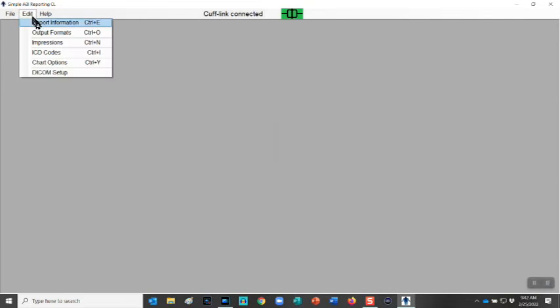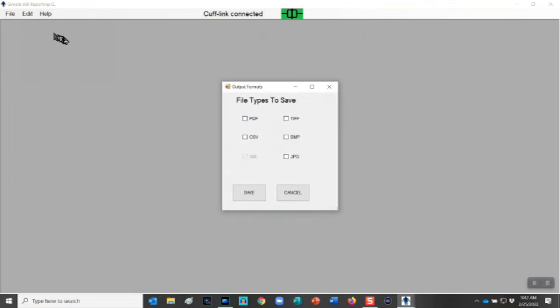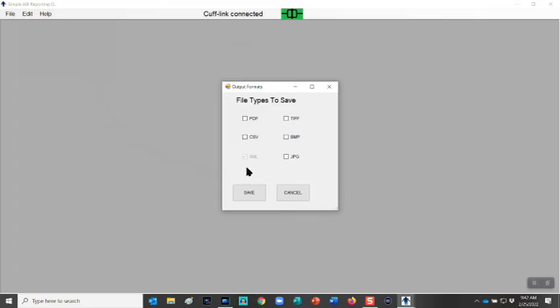To choose your desired formats, select the Edit menu and Output Formats. This opens a secondary window where you may select the desired formats to be saved.